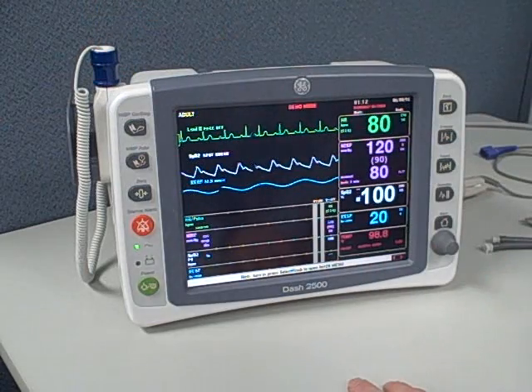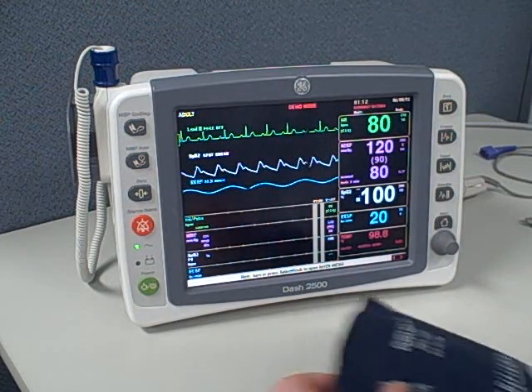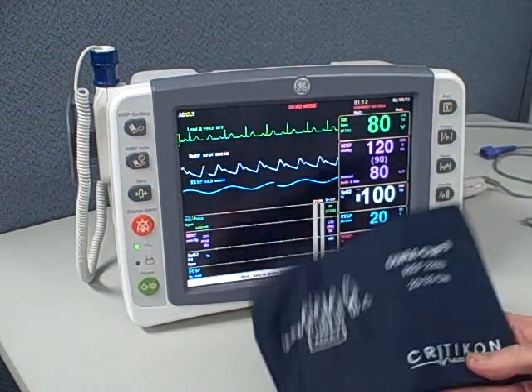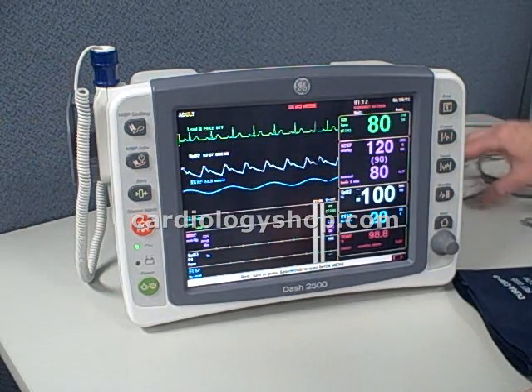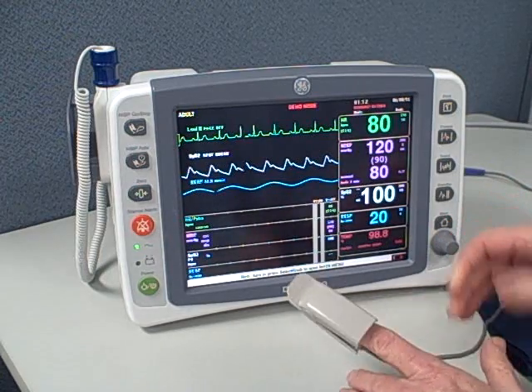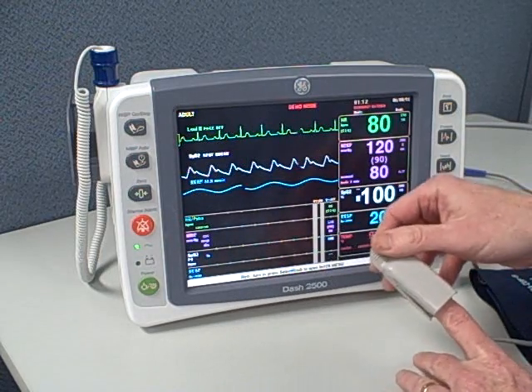An oral temperature probe, as opposed to skin probes. It uses the GE line of DuraCuff blood pressure cuffs. Also, the Nellcor pulse oximeter sensor is standard, with Masimo available as an option.